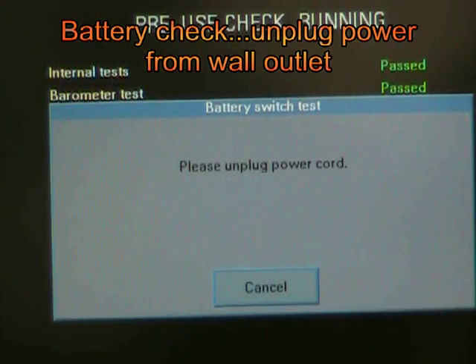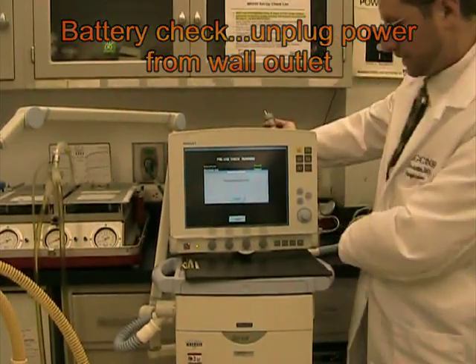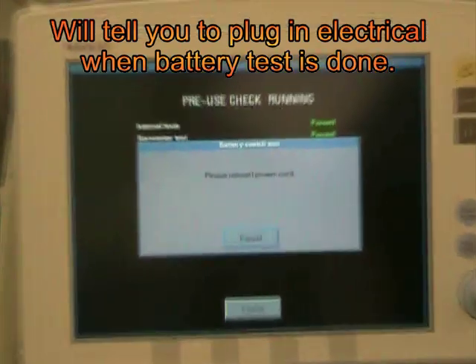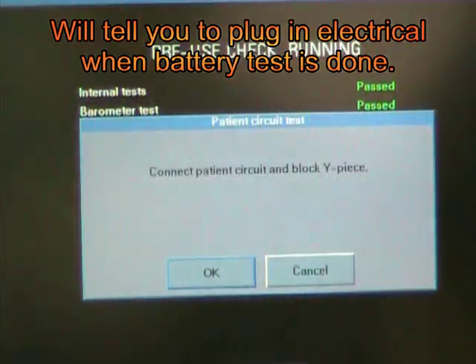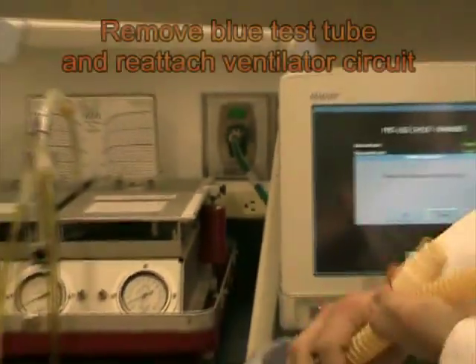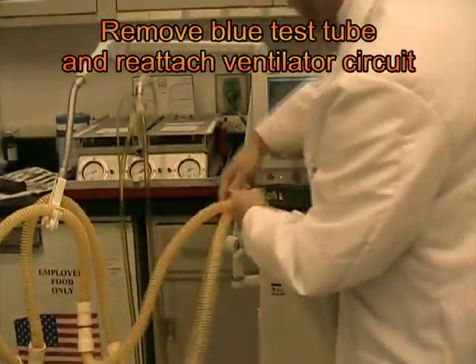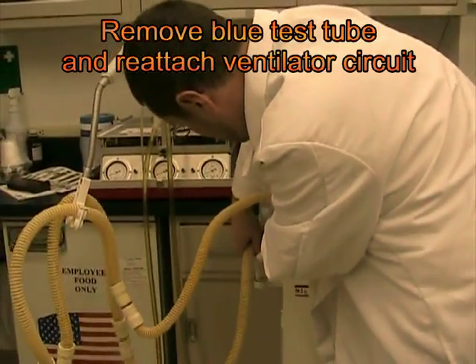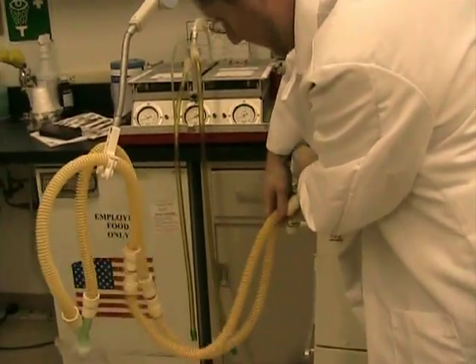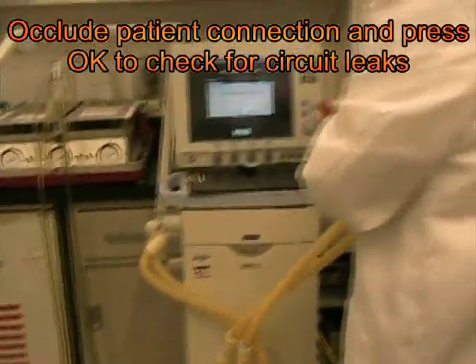We're just about done. The machine asks us to unplug the power cord for the battery check, and to reinsert to finish the check. The machine now asks us to take the short tubing away and reconnect the circuit, and to block the end of the circuit.